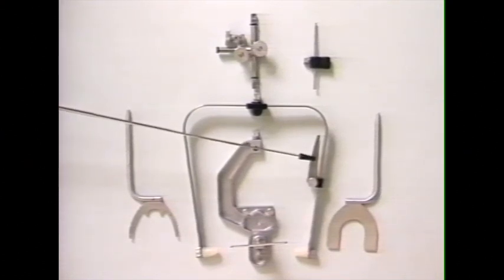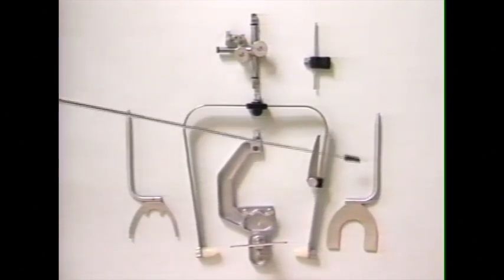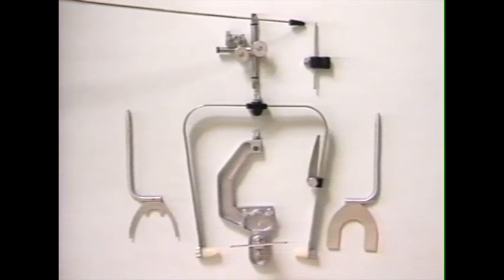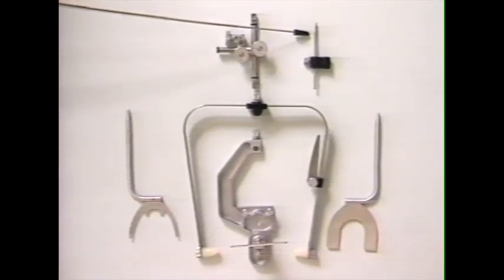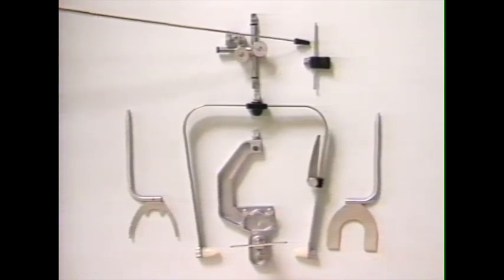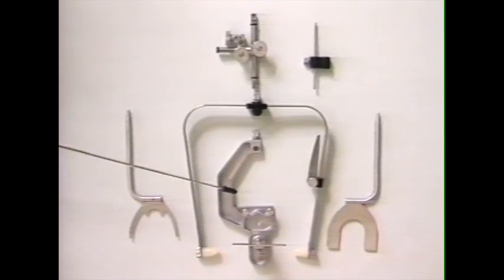This is the transfer clamp assembly, which attaches the bite fork or the bite plane to the Facebow itself. This assembly here is the anterior elevator, which allows direct transfer to the articulator from the Facebow, and this mounting platform with the built-in cast support, which allows mounting on the articulator without using the Facebow itself.